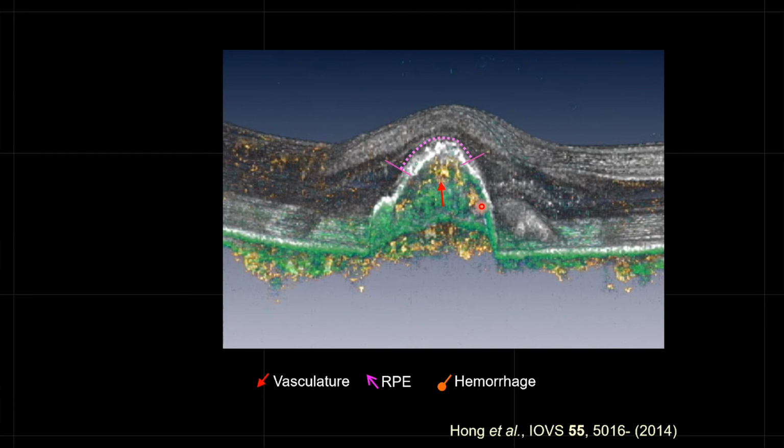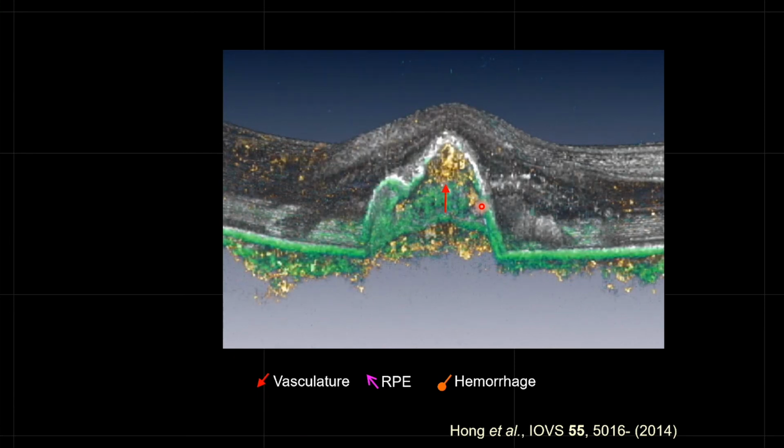This means this part of the retinal pigment epithelium, the melanin pigment, has already gone. The tissue itself is totally abnormal, not only its shape. And here, the situation becomes more and more severe. There is a very huge abnormal vasculature, and on top, melanin has gone again.